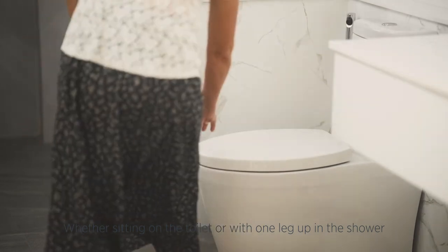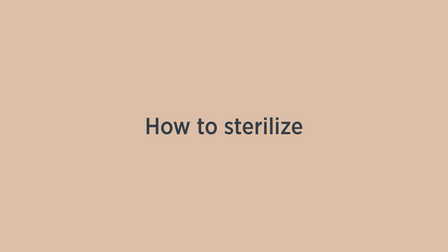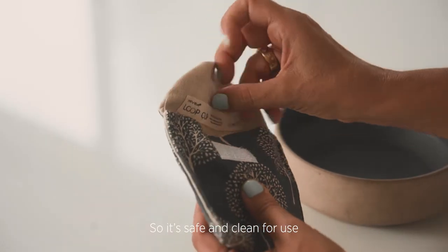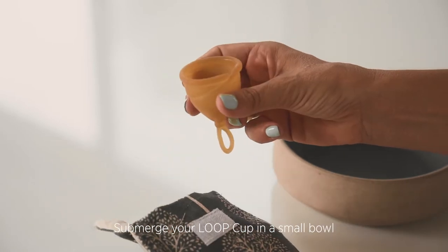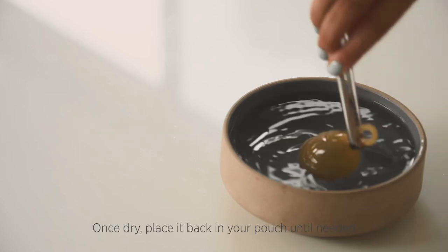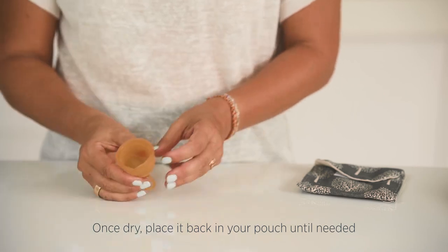Before using your Loop Cup, you need to sterilize it, so it's safe and clean for use. Submerge your Loop Cup in a small bowl of boiling water for 3-5 minutes. Once dry, place it back in your pouch until needed.